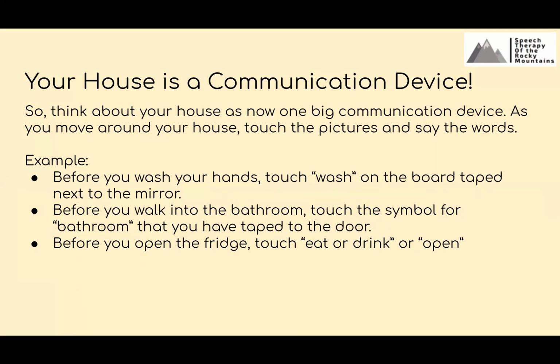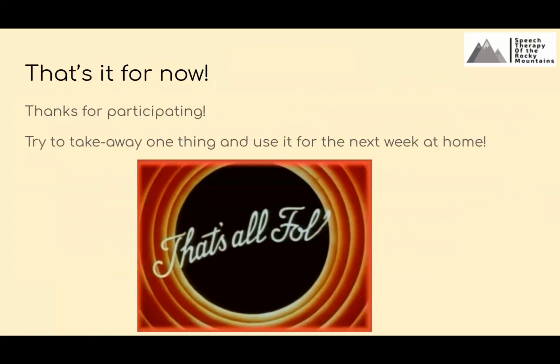I gave a couple more examples. For example, before you wash your hands, touch wash on the board, taped next to the mirror. Before you walk into the bathroom, touch the symbol for bathroom that you have taped to the door. Or before you open the fridge, touch eat or drink or open, and then get what you were planning on getting. So that's it for now.